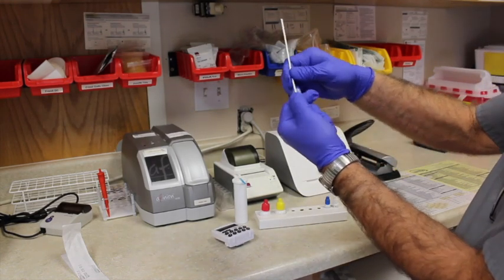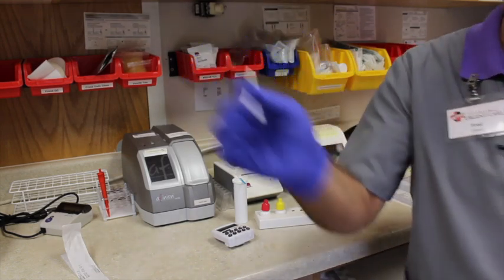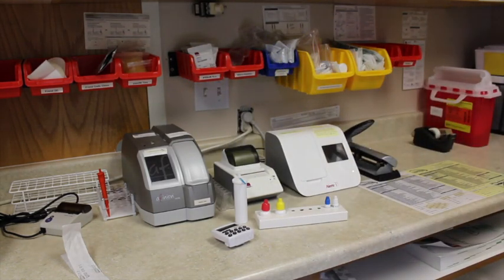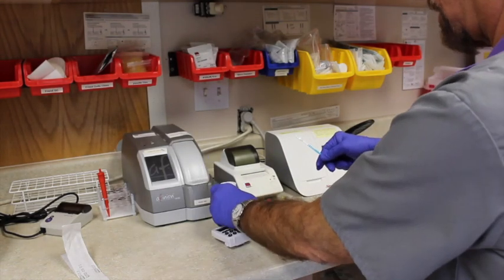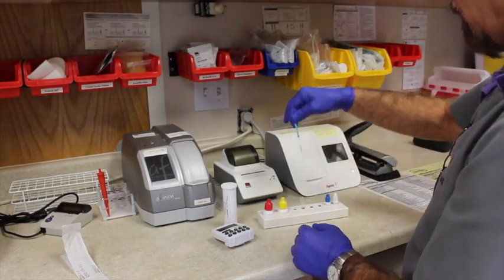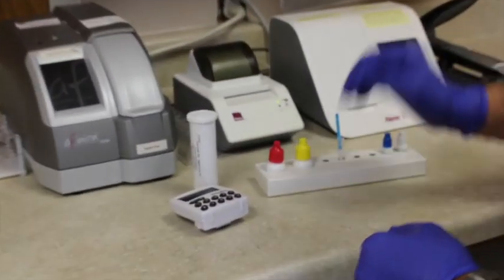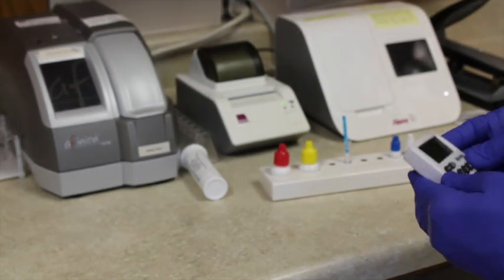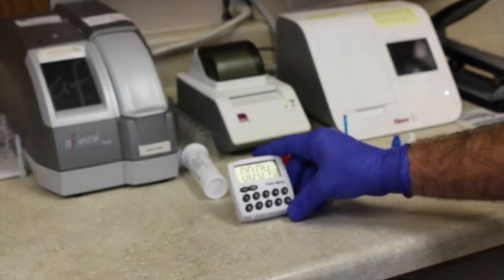Then you want to squish all the fluid out and throw the swab away in the biohazard. Then you take your strip out of the canister — the arrows show you which direction — and place it in the tube. It sits in there for five minutes, so set your timer again for five minutes.